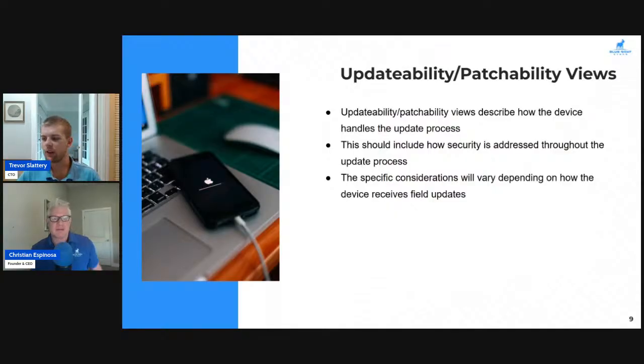Yep, and there are a lot of different ways to go about that process. We've seen solutions like that where we whitelist. You can even whitelist a specific brand of USB thumb drive and then pick something pretty obscure so that only service technicians have it. We've seen physical locks on devices and then a key. Even just epoxying ports shut can be a solution in some cases. And so there are a lot of different ways to go about this.